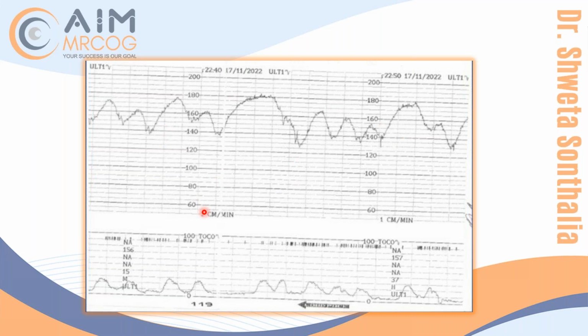You're perfectly right that the baseline is difficult to comment upon. But if you ask me, I might take 180 as the baseline. Only here it is sustaining for a while. Here it is sustaining for a while. Otherwise, it is all dipping up and down. Very difficult to comment. Either 160 or 180 could be the baseline, but it's very difficult to comment, as you told.